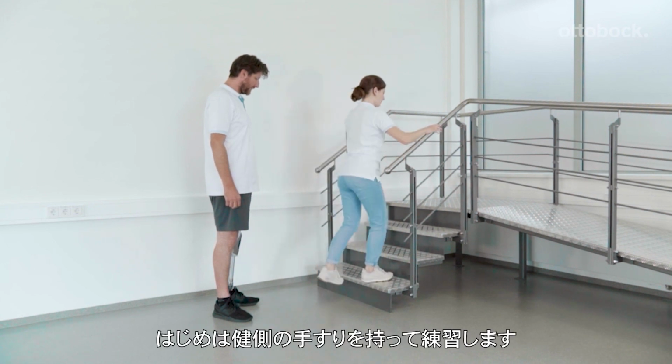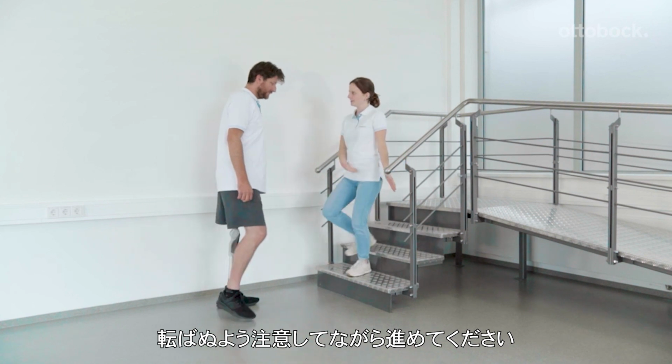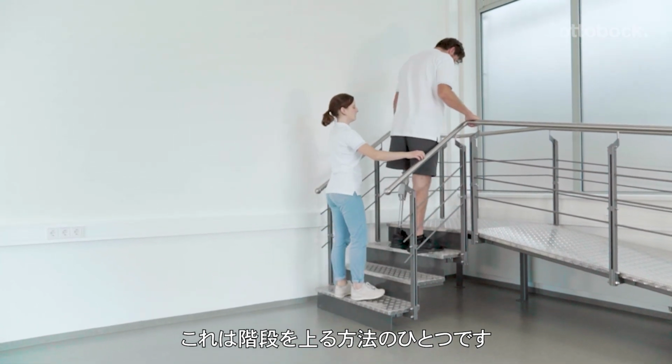Start using the contralateral handrail. For new or insecure users, start at the first step and progress as confidence increases. Shown here is one technique for going upstairs.